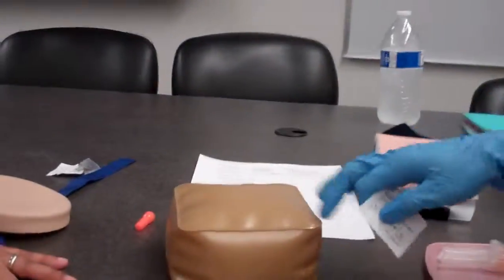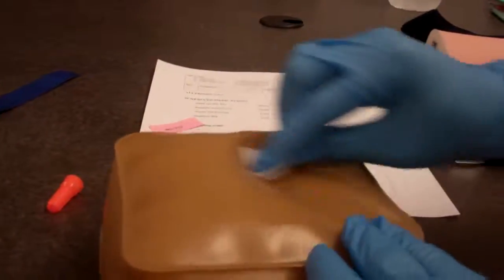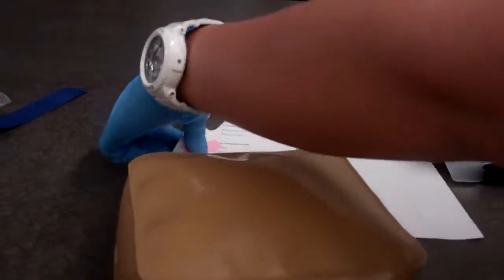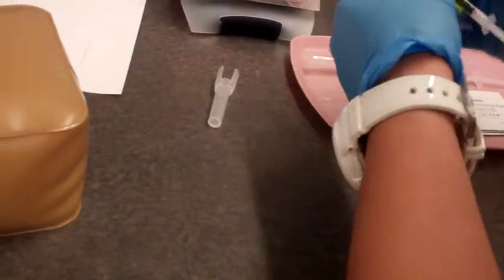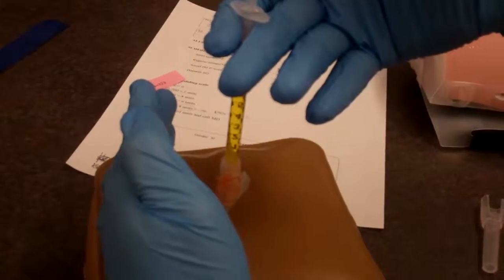So I'm going to check that the skin is intact, no lesions or trauma or inflammation. I'm going to wipe it for 30 seconds. Make sure that dries. Okay, and since it says here on my MAR to do Z-track, all I'm going to do is push the skin to the side so it can lock in the medication. So I'm going to uncap after I make sure that it's dry. I'm going to insert it like a dart as I push the skin away, 90 degrees. Inject slowly.